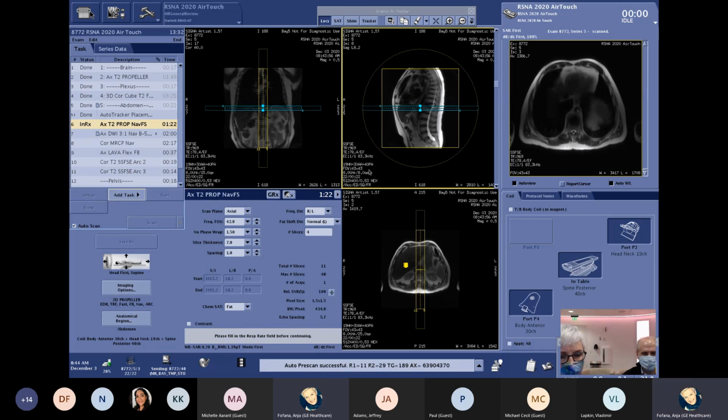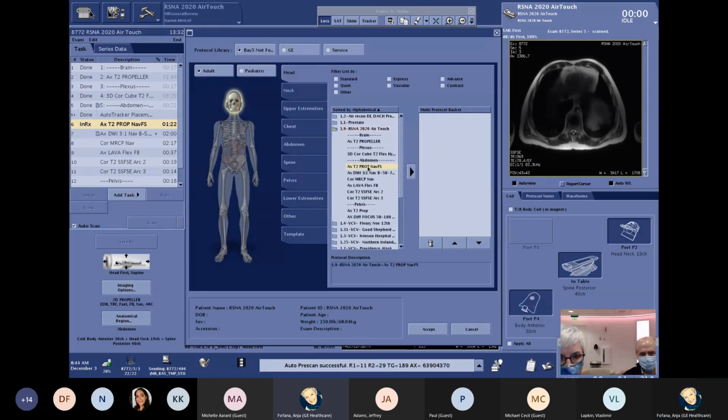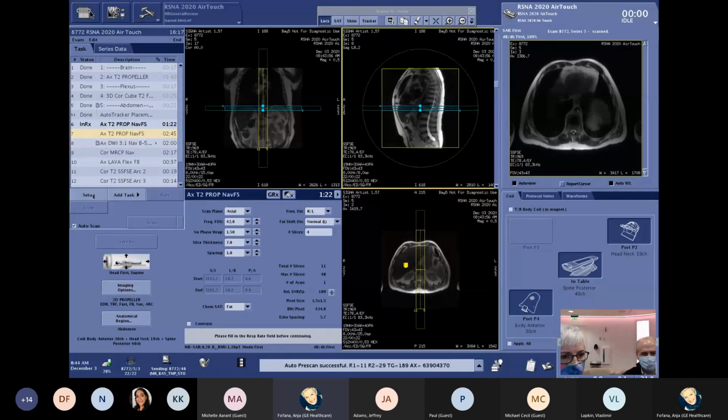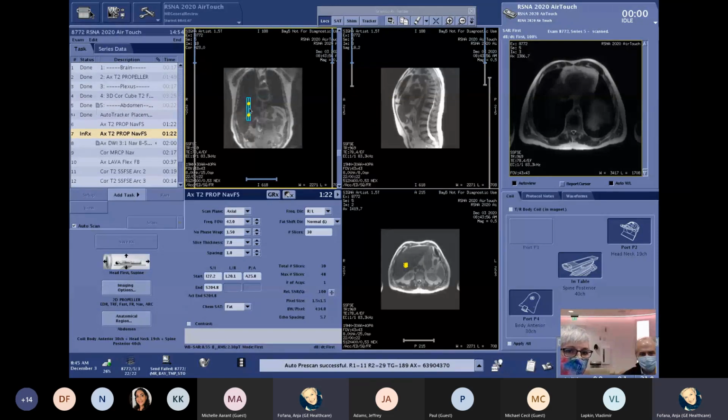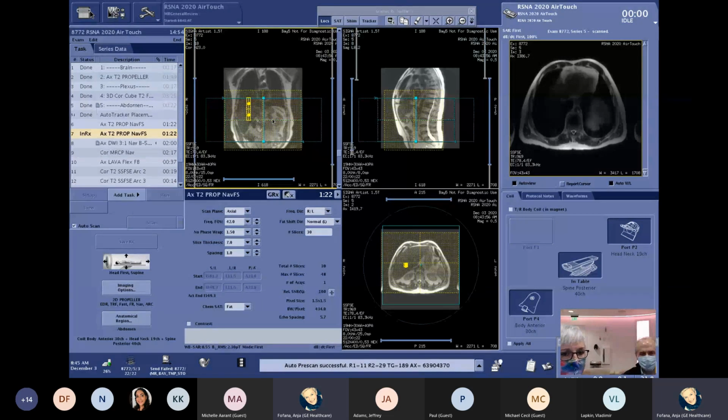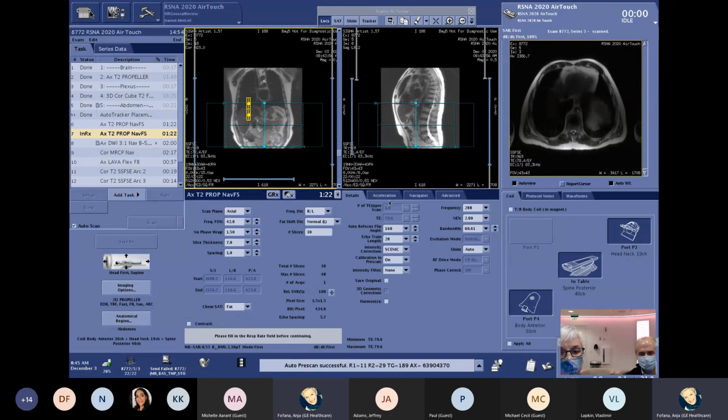I will just pull it over one more time. And I want to scroll through the image here first, because I want to highlight that the navigator, which you can see here covering the diaphragm in the perfect spot, has been placed automatically. So it is placed automatically because what we did after the localizer, we told the system, please do a post-processing task. And this post-processing task you can see here is labeled as auto tracker placement. So the system will, as soon as the localizer is done, find your diaphragm and place accordingly. And that, again, helps a lot with consistency.